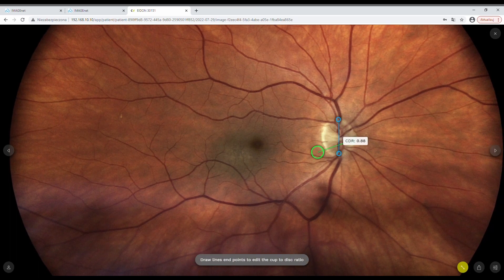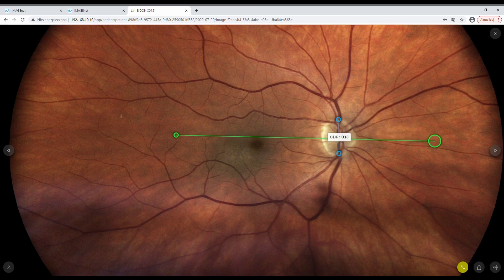Another feature is the caliper. There is an option to measure cup-to-disk ratio: you simply draw two lines and the machine calculates it automatically.